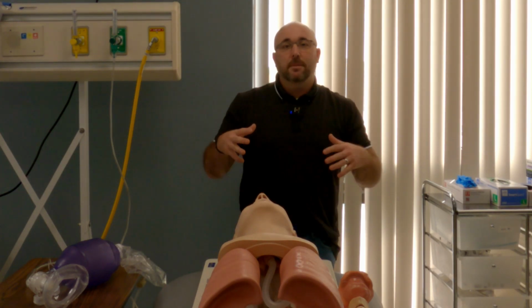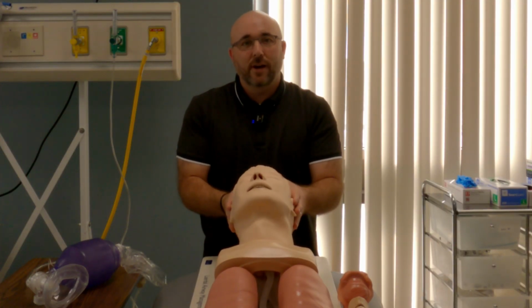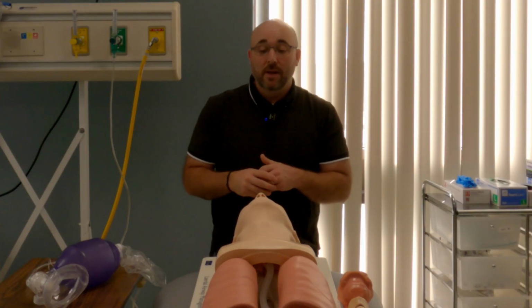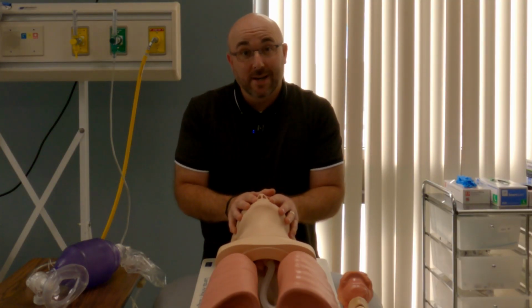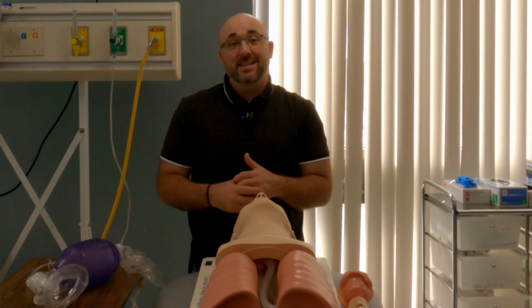intubation. So the first thing we're going to talk about is the person that is going to be intubating the patient. Now this is Fred. Say hi, Fred. How's everything going? This is Fred the head. So we're going to use him. I'm going to talk a little bit about how that assistant is going to help the person that's actually placing the airway, because you're really only as good as the person that's assisting you.